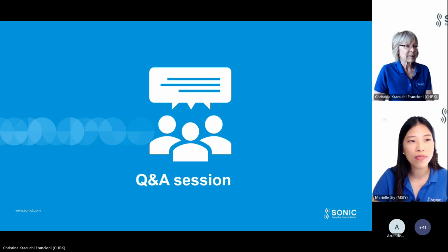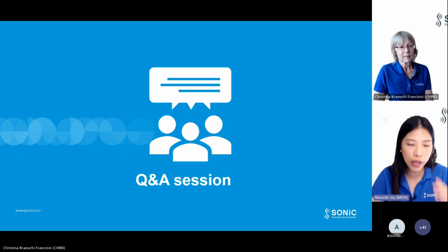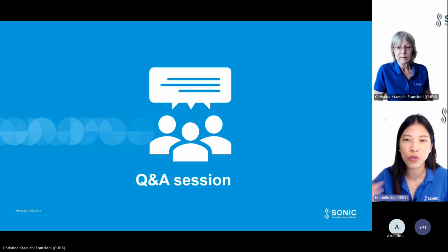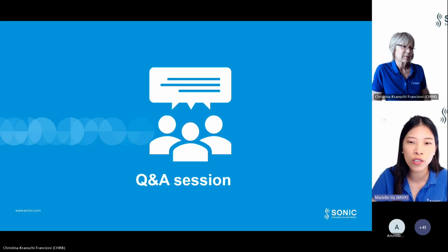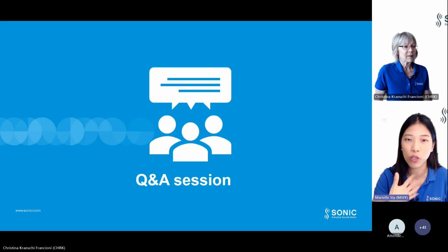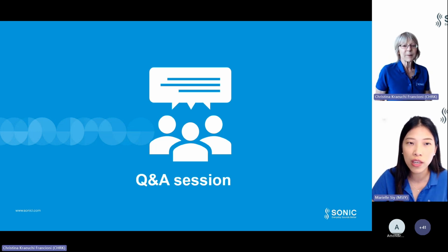And yes, if I may add something, I did have a few clients before who had these issues. A lot of them were using custom hearing aids to have these hands-free phone calls. And it certainly helped when I taught them how to mute the microphone whenever they're having a conversation with another person using their phones. Correct, muting.